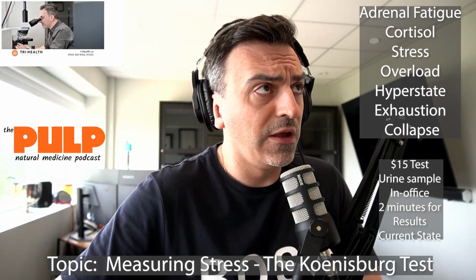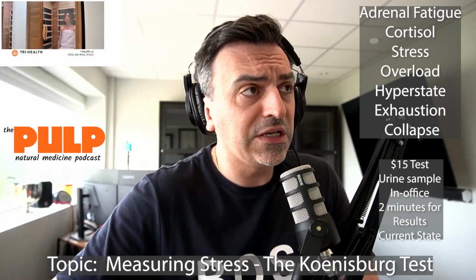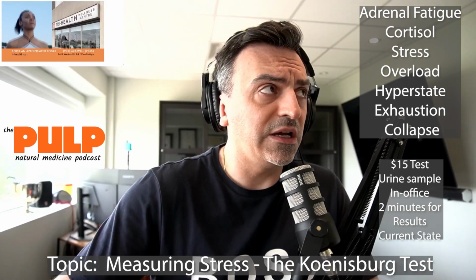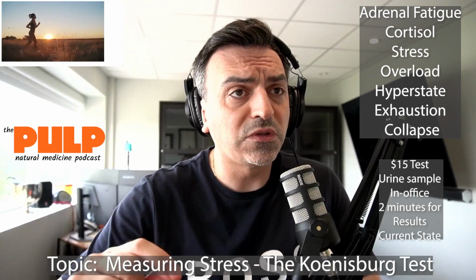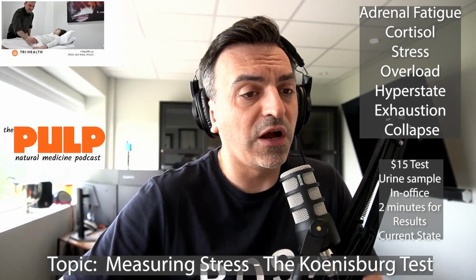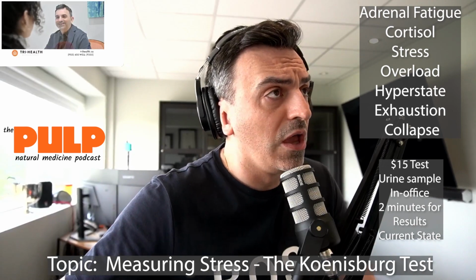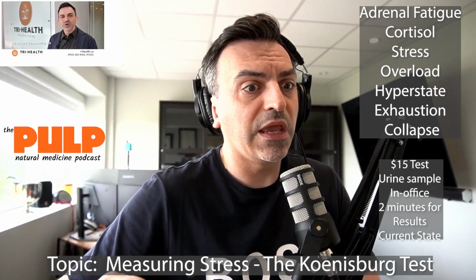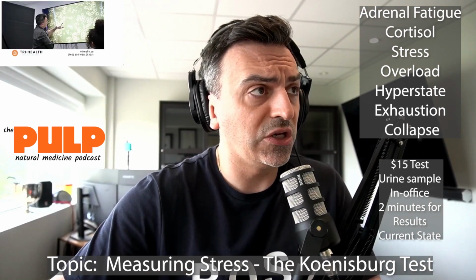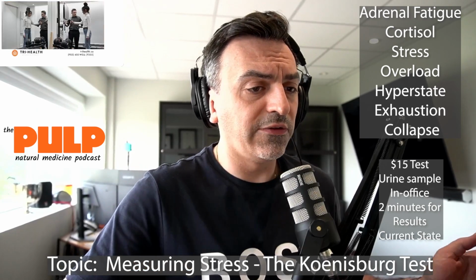and it's done in office in our lab, and it's a urine test, and you don't need a lot. Technically, you just need 10 drops of urine. You're adding a couple chemicals, and it's a reagent test. So I'm literally adding drops to see how many drops it takes for there to be a color change. And depending on how many drops are required, usually, obviously, the urine mostly is clear to yellow. It'll turn a deep red, almost instantaneous, so it's very clear at what point it changes color. Depending on the number of drops it takes, it puts you in one of three categories.